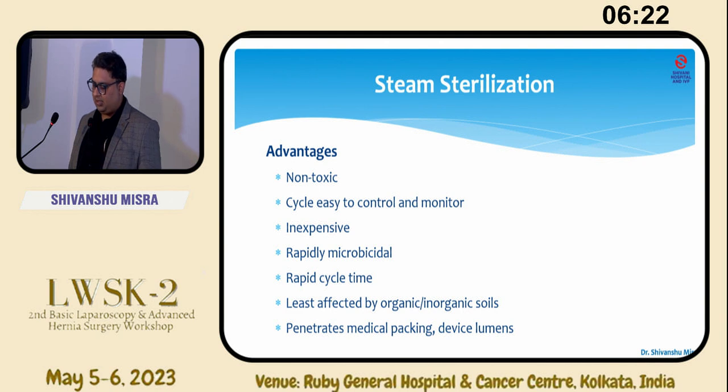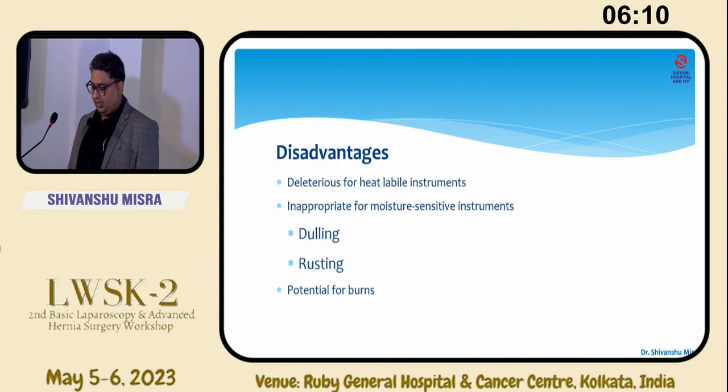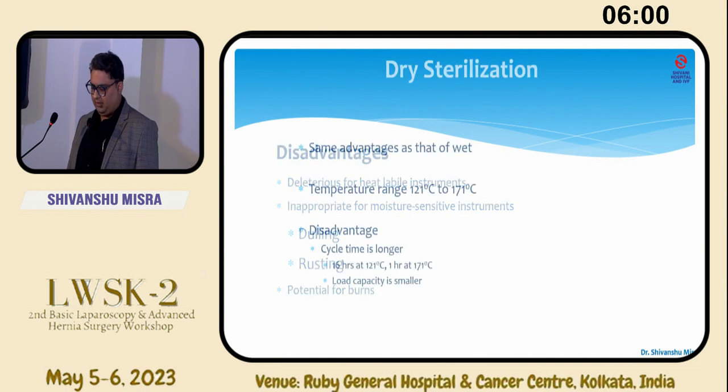We have a rapid cycle time, and it has good efficiency, I would say, of sporicidal activity if done properly, and it is least affected by organic and inorganic soils. Okay, and what are the disadvantages? It is not good for heat labile instruments. It can cause rusting of the instruments, and it may cause some burns if not handled properly.